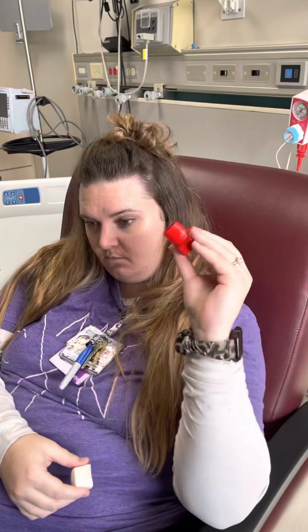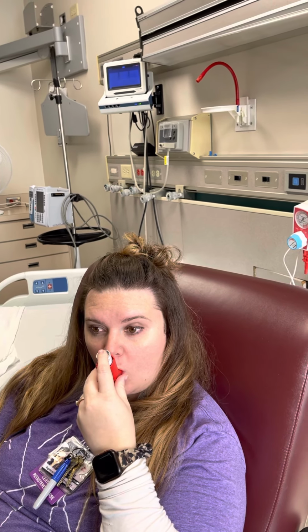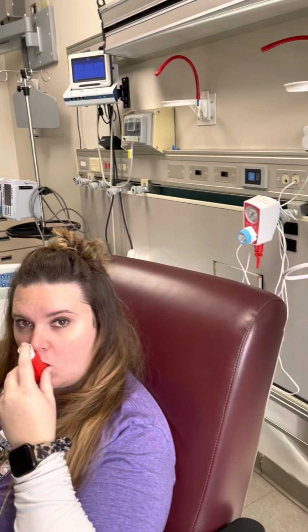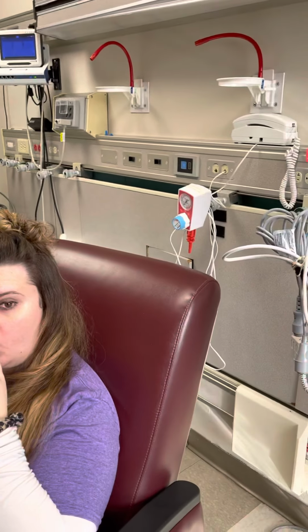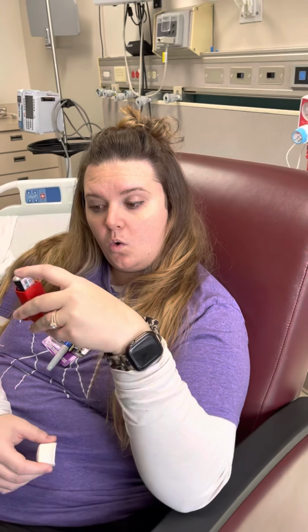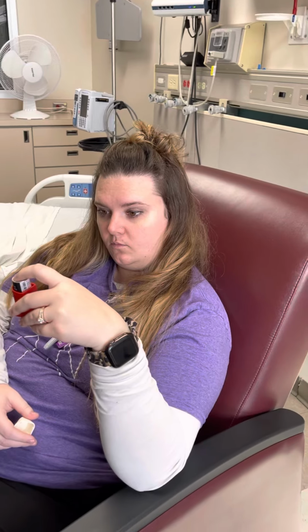So you'll make sure that you take the top off. You're going to shake it really well to mix the medication. Put the inhaler in your mouth, and then tell your patient you want them to exhale everything from their lungs. Put their lips tightly around the edge of the inhaler, and then depress to administer the medication as they deeply inhale over 3 to 5 seconds. Once they do that, they need to hold their breath for about 10 seconds while the medication absorbs, and then they can slowly exhale. If they are taking more than one puff, you want to let them have about a 5 to 10 second break in between so that they don't become hyperventilated.